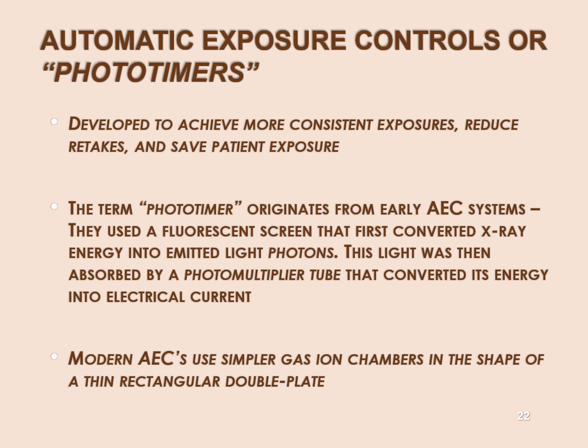It's too bulky, it's too cumbersome, and it's not as efficient at the job, it's not as effective at the job as the ion chamber design. The ion chamber design is a superior design. So our AECs in the modern era, probably since the mid-1970s, have been ion chamber design, instead of fluorescent screens and photomultiplier tubes behind the cassette, the image receptor.